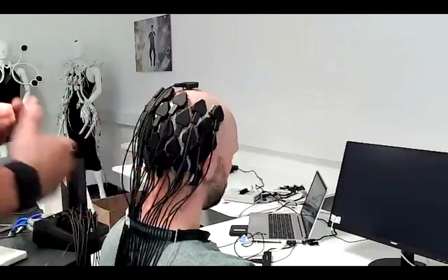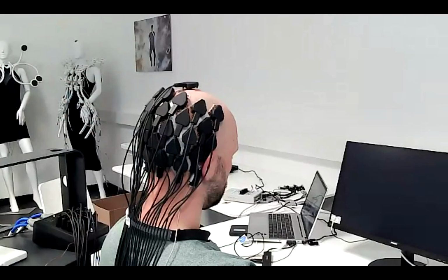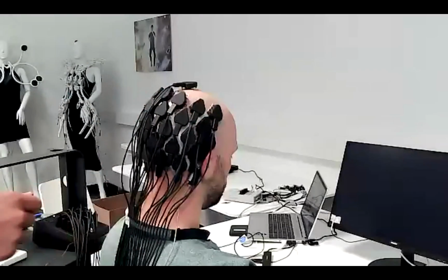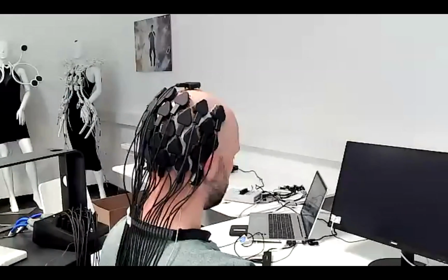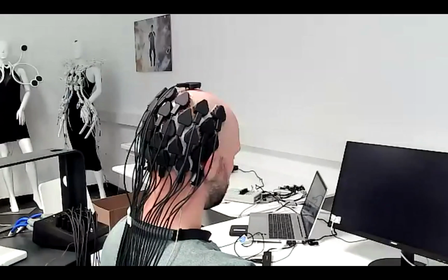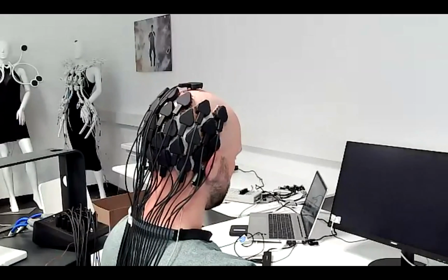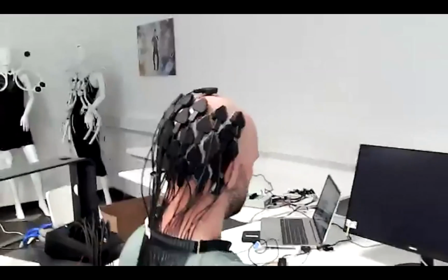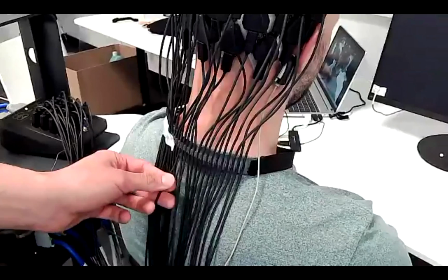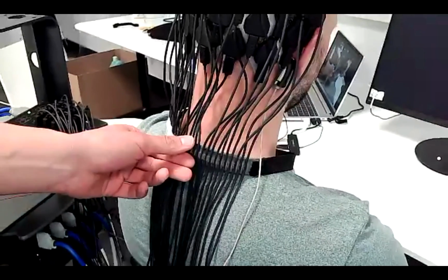Of course, there are different head shapes, and this also depends on how good the electrode coverage is and how much distance there is between grids.